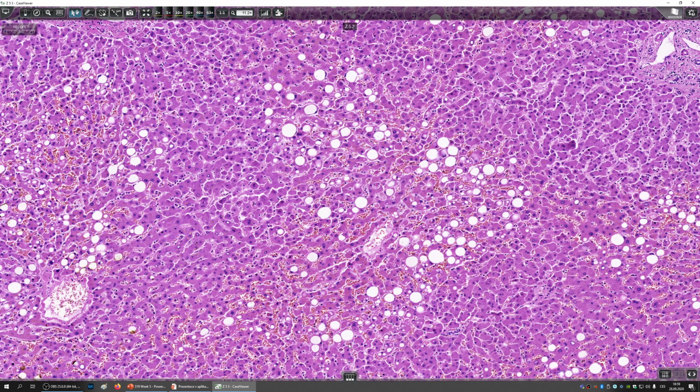Here we don't see the steatosis because this person is drinking alcohol. This person might have drunk alcohol, but I don't think it's that. This change happens because due to chronic venostasis there are metabolic changes. There is metabolic deprivation within these hepatocytes, and the stereotypical way that the hepatocyte reacts to this kind of metabolic damage is by doing steatosis, because the free fatty acids and triacylglycerides start to accumulate in them.